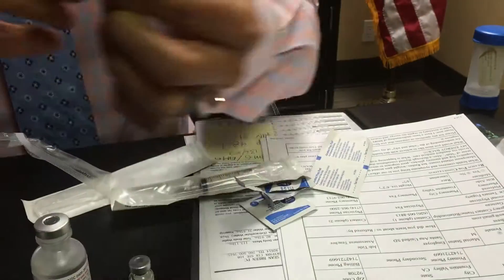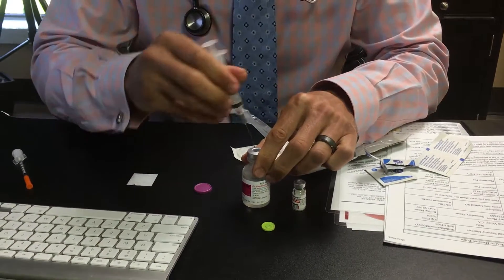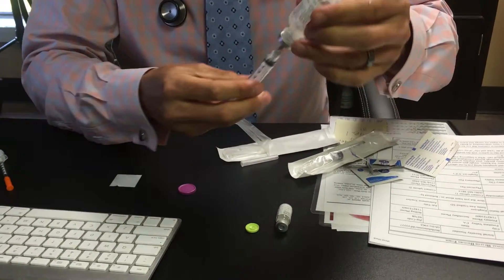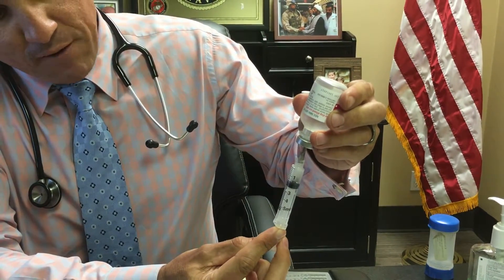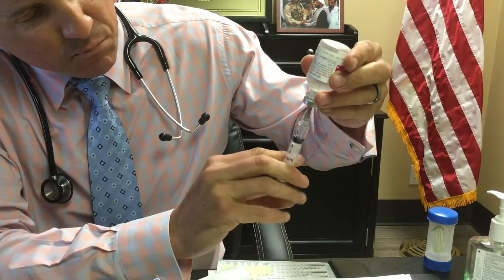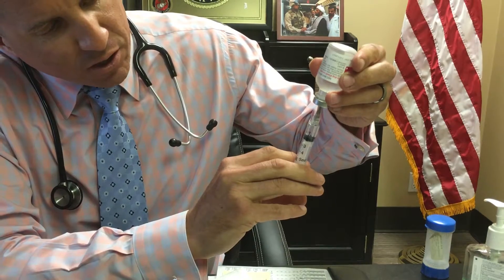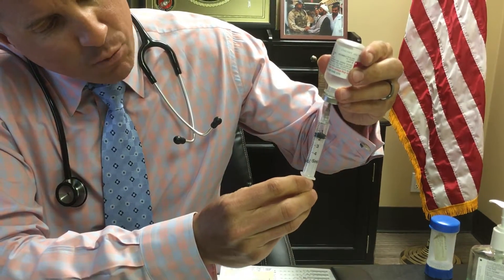Insert the needle into the bacteriostatic water vial, turn it upside down, and withdraw 1.5 ml. Sometimes you'll have to pull a little bit past and then push back out to the 1.5 mark — which again is just midway between the 1 and the 2 lines. Then take the needle out.